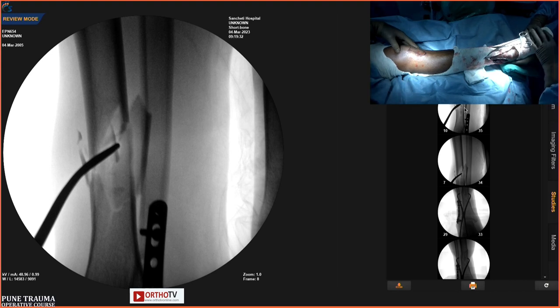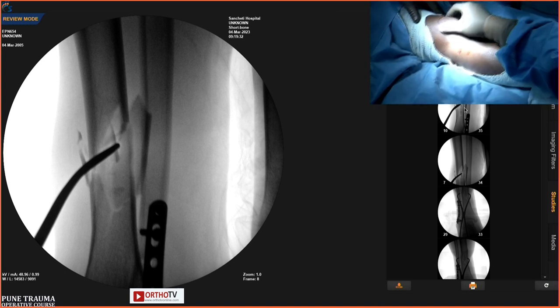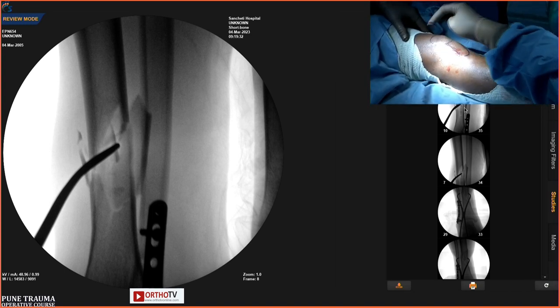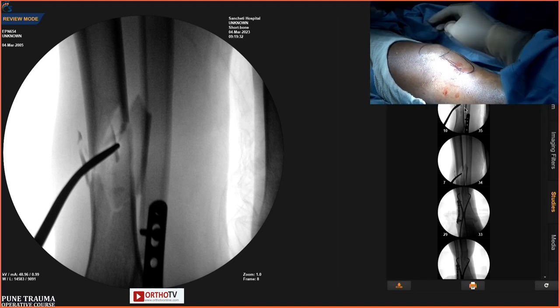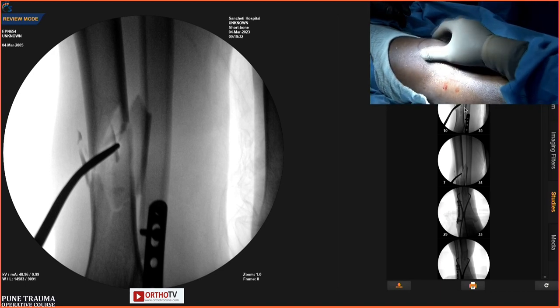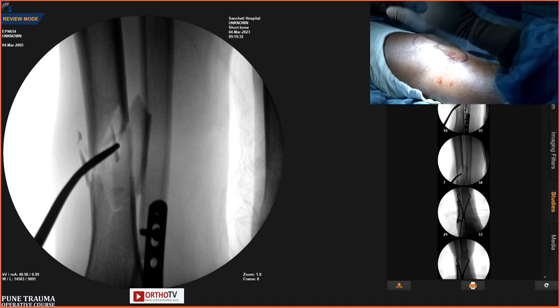Yes, yes. So now we have seen the palpability also. Now we can see the patella is palpable here. Our incision will start 1 centimeter above the upper pole of the patella. Now Dr. Chetan Pradhan is doing and I am assisting him. There is no issue. So give the incision.